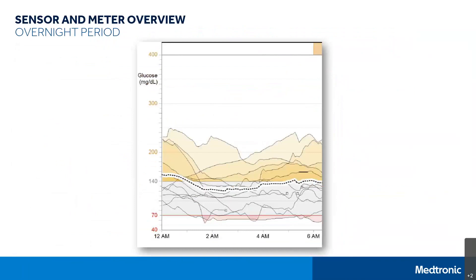Let's look at the overnight period first. It's important to look at this section of the report to see if your basal rates are appropriate. Having the right level set will help you stay more stable at night and reduce the number of times you wake up high or low in the morning. We've zoomed in on the 12 a.m. to 6 a.m. time period. I recommend focusing on the darker shaded areas, as that is where there's a more consistent pattern. The black dotted line is typically the average glucose values. In this example, you can see this person is dealing with some lows at night, as indicated by the areas shaded in pink and red. The darker shaded areas indicating frequent highs or lows should prompt you to talk to your healthcare provider about making basal adjustments at night.